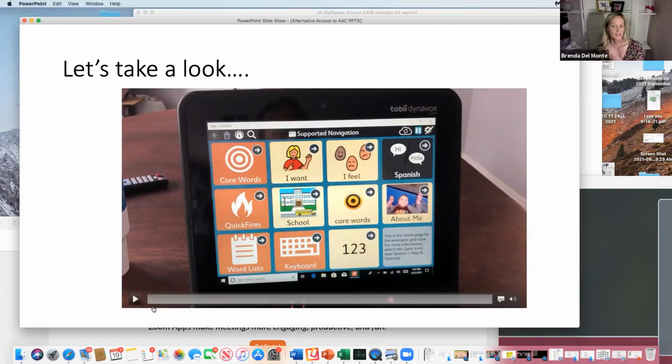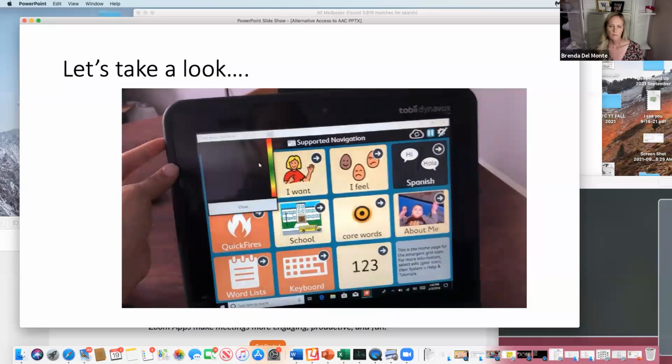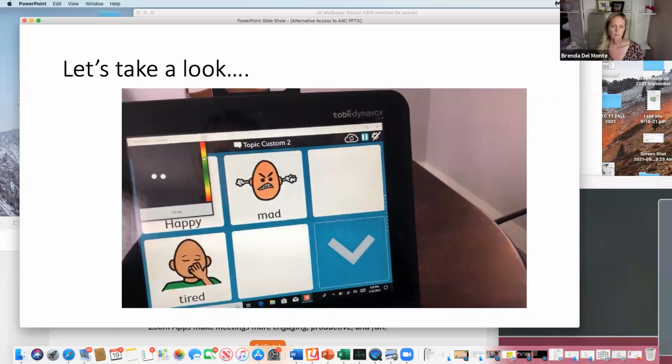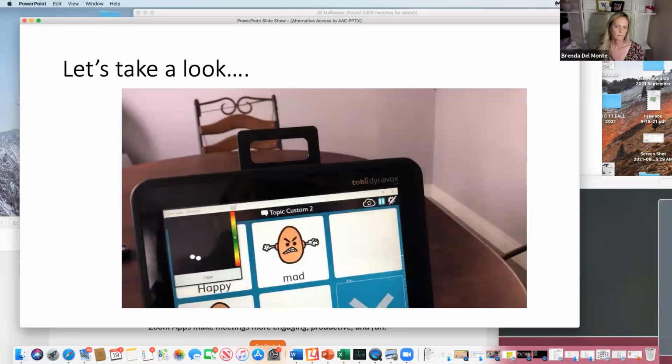This was something I did for a boy, and so I was just making a video for the layout so that the school was oriented. So here is his device, and the top button is going to show his eyes. You want the arrow to be right at the green, so you know that you are not too close, which is when the arrow is high, or too far away, which is when the arrow drops too low.